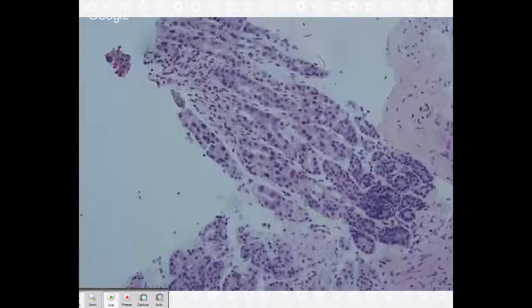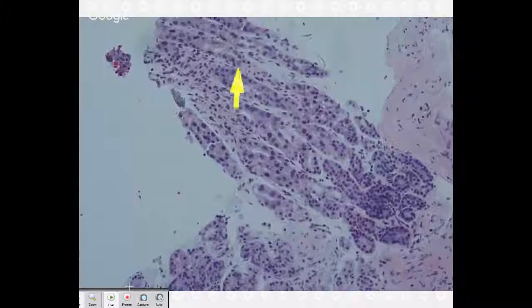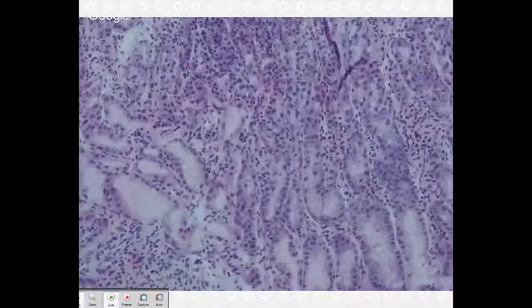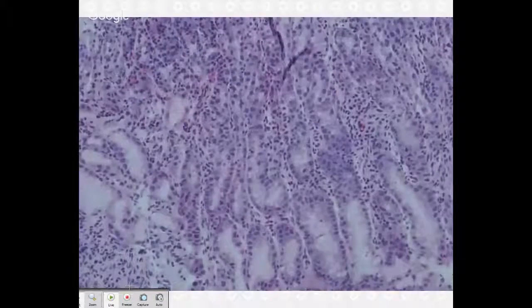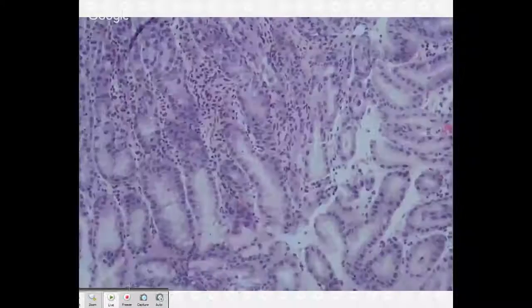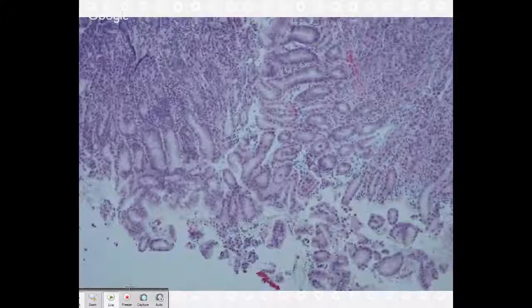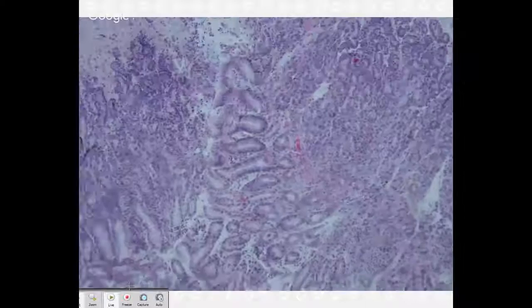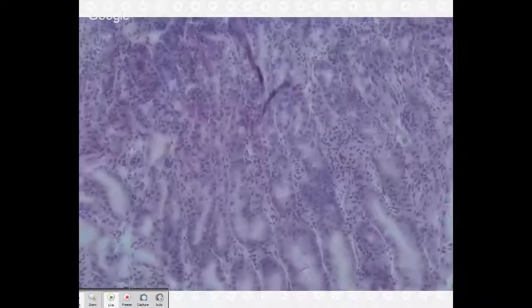Maybe some kind of atypia, neoplasm. All right, so that was the question. This was a consult case that came in, and it was, what is this? Is this cancer? Anybody? This is mitosis, like a ring form. They are ring form mitoses. That is excellent. So these are ring form mitotic figures.